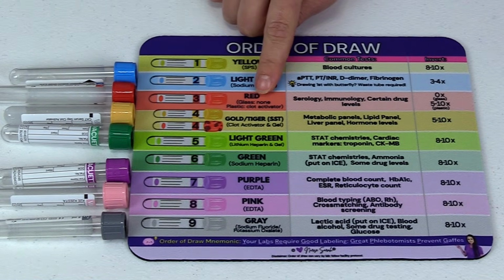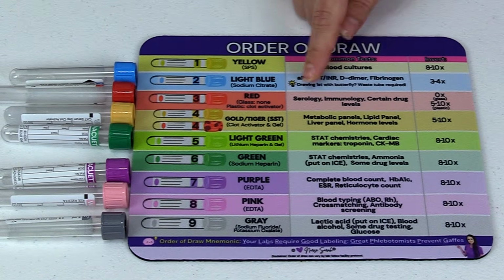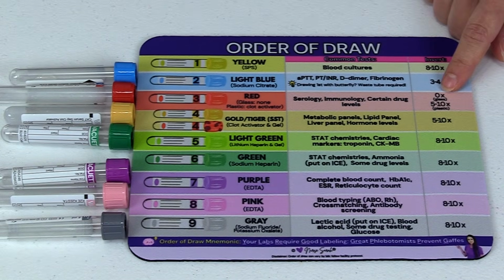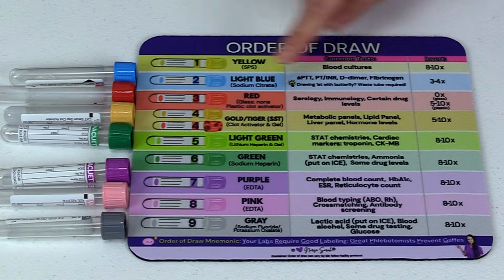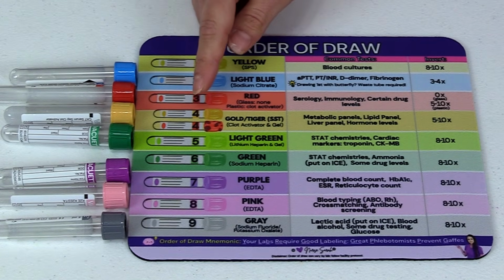In the glass tube, it doesn't have an additive. In the plastic, it has the clot activator. Here, you're going to have serology, immunology, certain drug levels. Inversion time: none for glass, 5 to 10 for plastic. Followed by that will be your gold or your tiger, your SST tubes, your serum separator tubes.